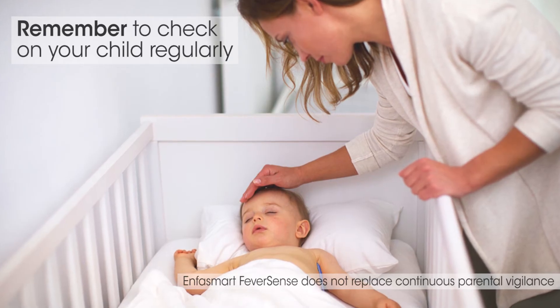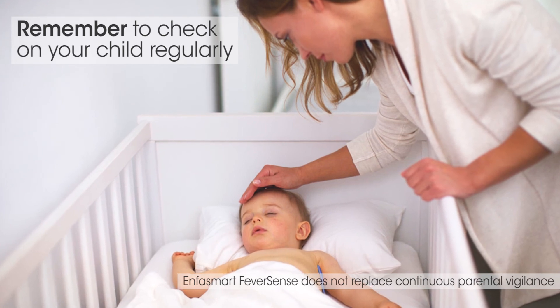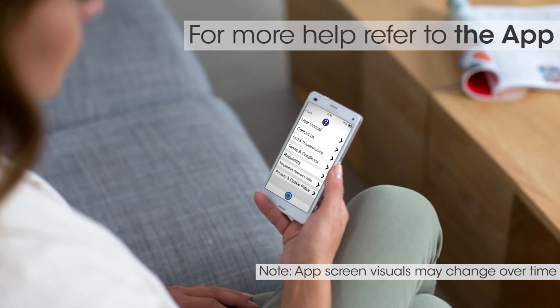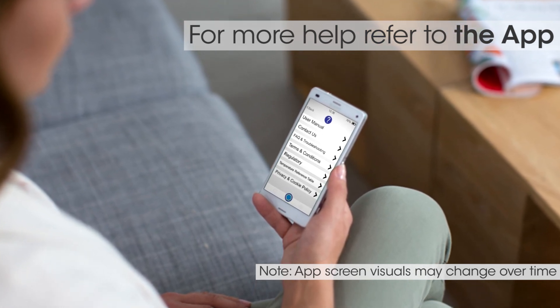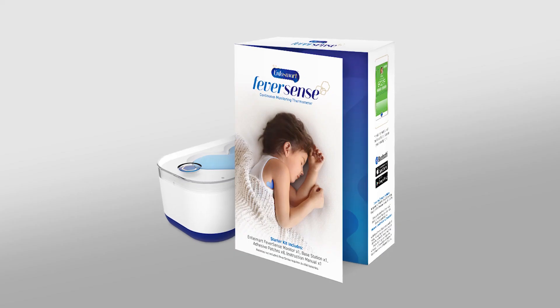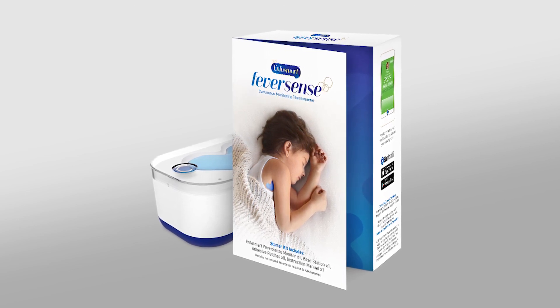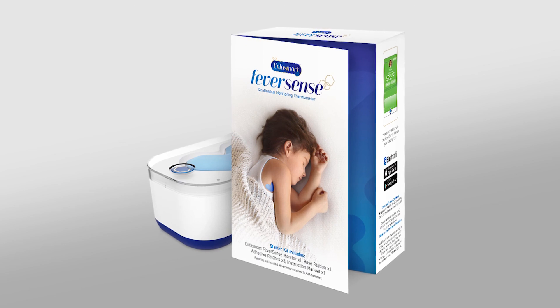Finally, remember to check on your child regularly for other signs or symptoms. For more help on using FeverSense Temperature Monitor, refer to the Settings section of the app. FeverSense Smart Temperature Monitor — now you can feel in control as you monitor your child's fever.